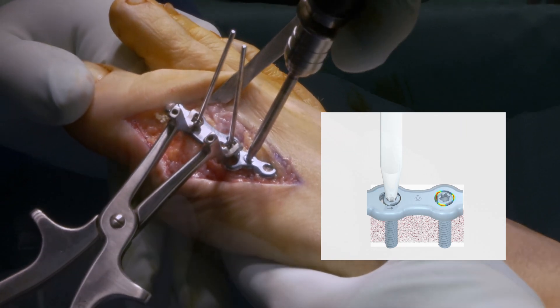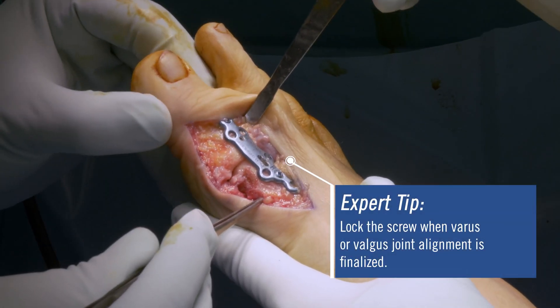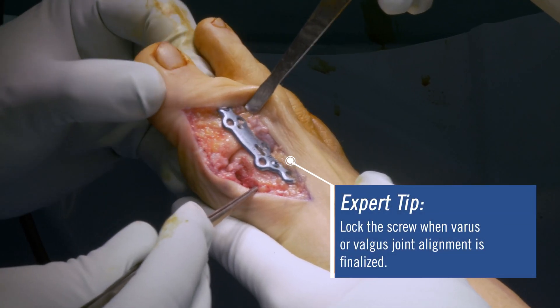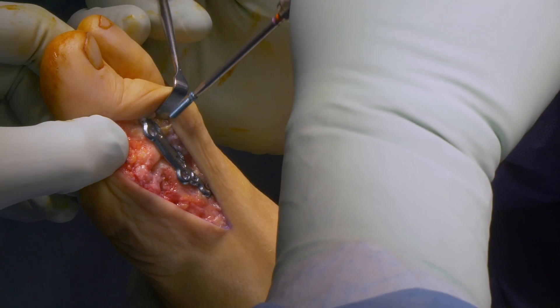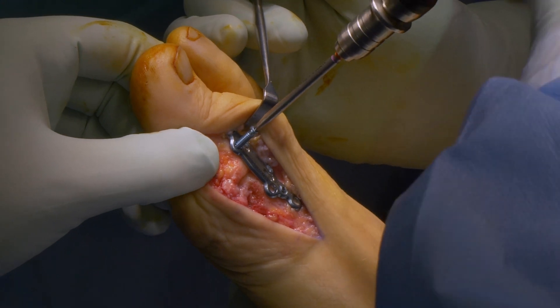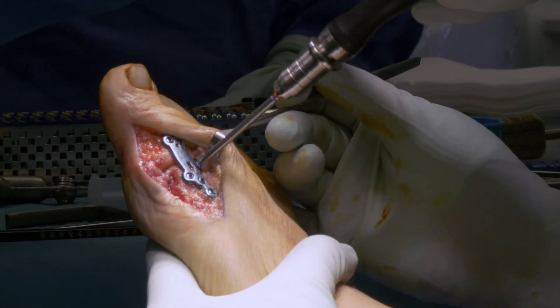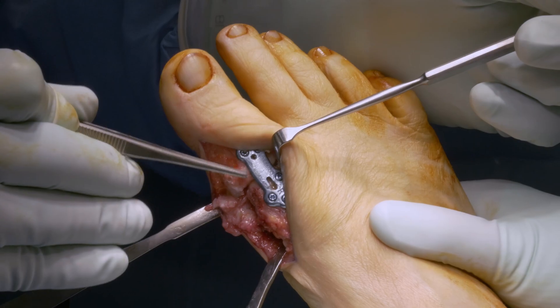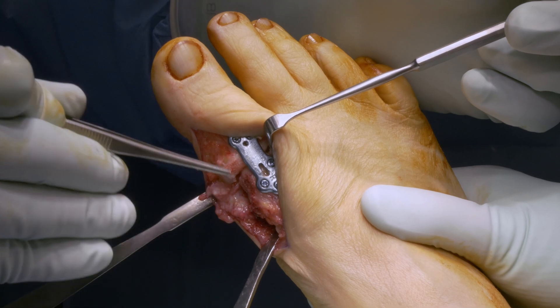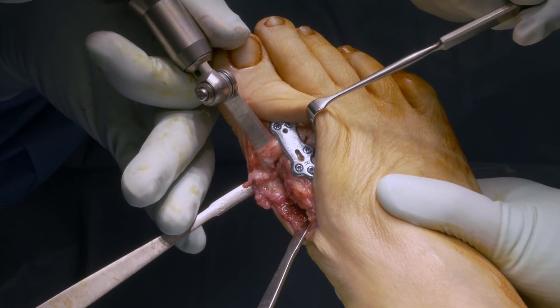Lock the screw when the varus or valgus joint alignment is finalized. Once the perfect position is achieved, the remaining holes can be filled with locking screws. Avoid bicortical fixation of the two most distal screws in the MT1 to reduce the risk of sesamoid irritation. After final fixation, the protruding bone can be removed with a saw to avoid any soft tissue irritation.